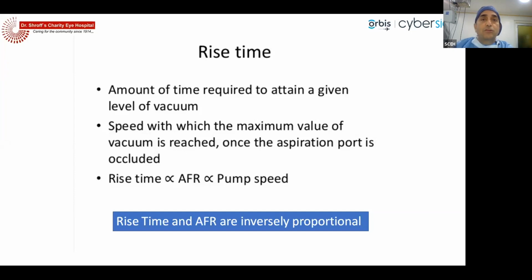That's because one has not allowed enough vacuum to build. So once you have used a burst of phaco, go inside the piece, stay there, and allow the vacuum to build. Most machines will have a bell or it reaches a crescendo. Wait for that, and only then start pulling it. That way you will prevent that piece from falling.